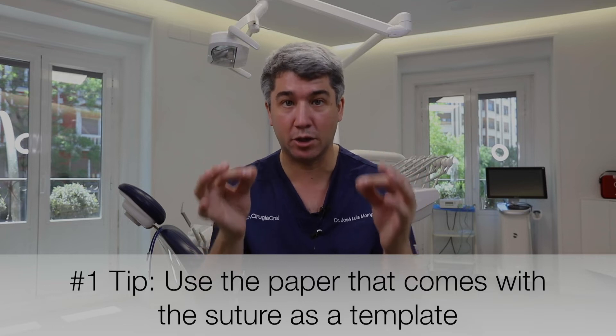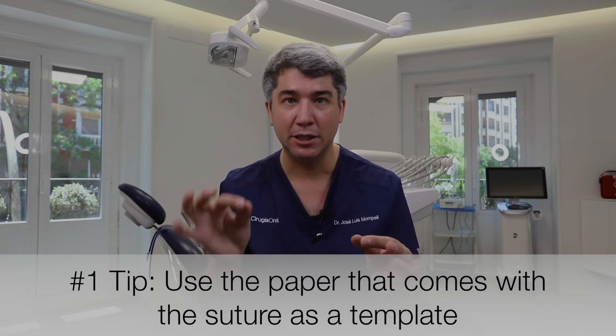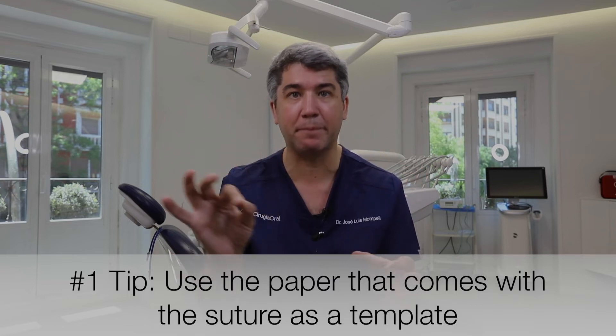The envelope where the suture comes in — we are going to use it as a template. We're going to go to the recipient site, cut that little paper down to size, then go up to the palate and we will have a template. We just need to follow the edges to be sure that we are harvesting a free gingival graft with exactly the size that we need — not bigger or smaller.